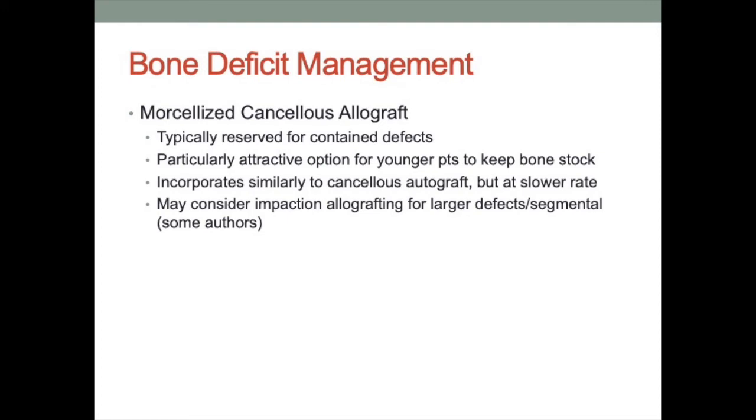That's where basically you put it all the way down where your stems are going to be if you have a big dilated ectatic canal or metaphyseal region, and then you impact your implant into that, which essentially then crushes all the graft to the periphery but sandwiches it all around the implant to help out with interdigitation.